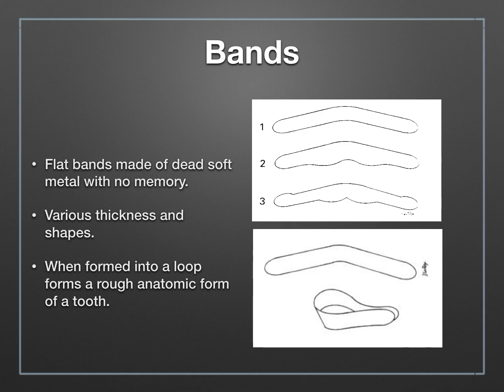The bands are made of a dead soft metal that has absolutely no memory, meaning they won't spring back into shape — once you fold them, they stay folded. They come in various thicknesses and shapes depending on their usage. The ones with little bumps, number two and number three, are specialized matrix bands for subgingival cases. Those bumps extend subgingivally where your gingival margin might be located, to help contain the filling material. The most standard band looks like a boomerang; when you take the two ends and join them together, you create a loop — a cone that mimics the general shape of a tooth.